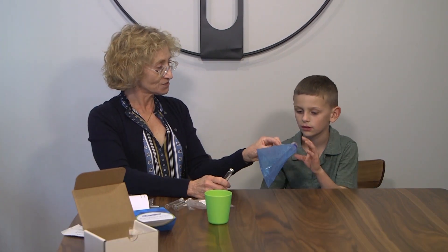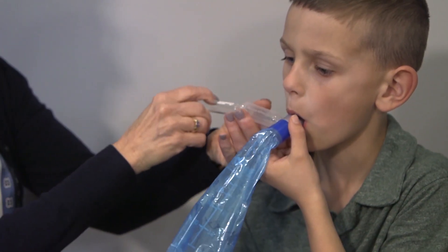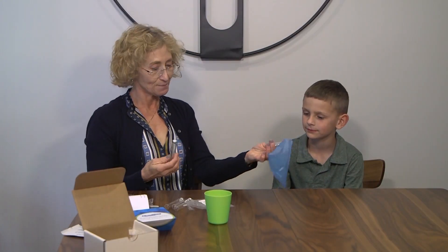Our final sample is done three hours after finishing the drink. So, Conley, put that in your mouth. You make a tight seal. Now, start blowing, and I will put the tube in. And you're all done. Good job — we're all done.